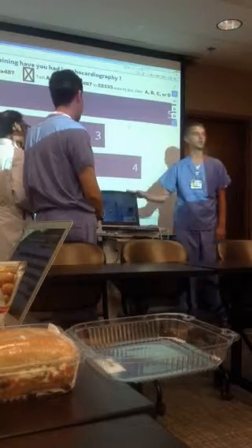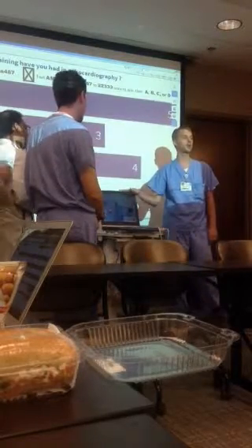And honestly, if you upload the patient from the lab before you leave, you'll already have all the patient information in here, so you won't need that.